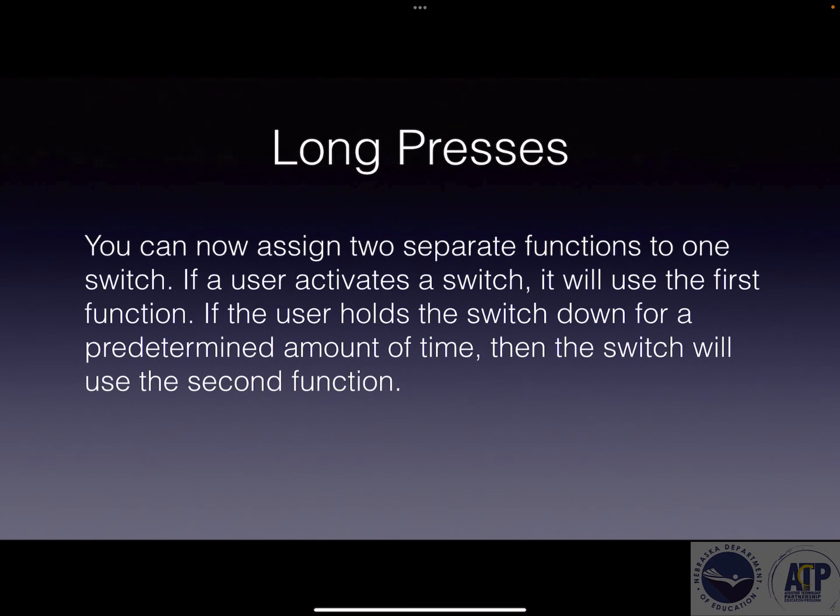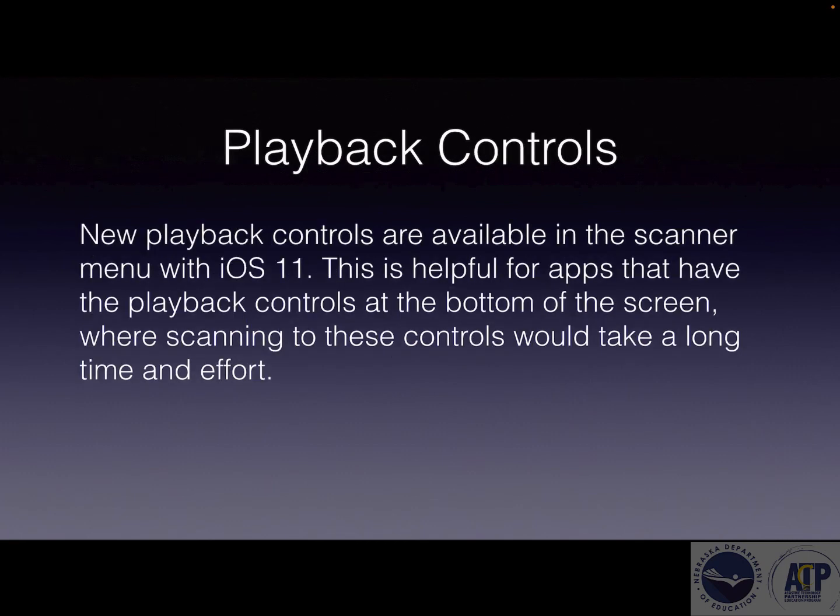Long presses, that allows you to be able to press for a specific amount of time on a switch. And once you do that, a secondary function will happen for a specific amount of time. So it will use that secondary action. So basically you're turning 2 switches into 4 switches or 1 switch into 2 switches or 2 actions that will be performed when you touch that.